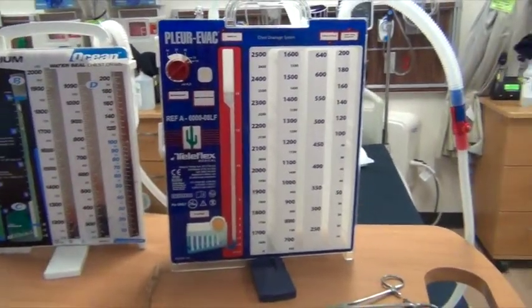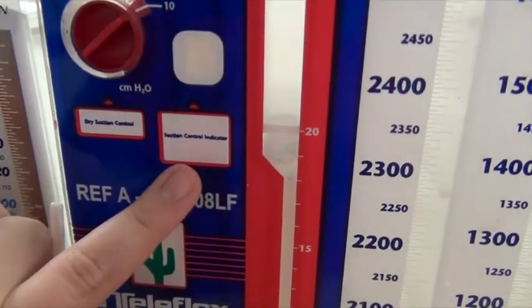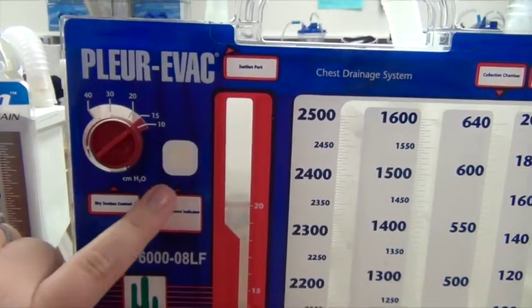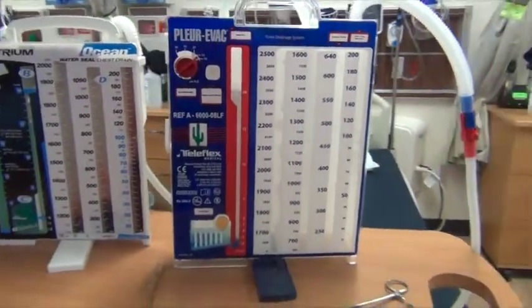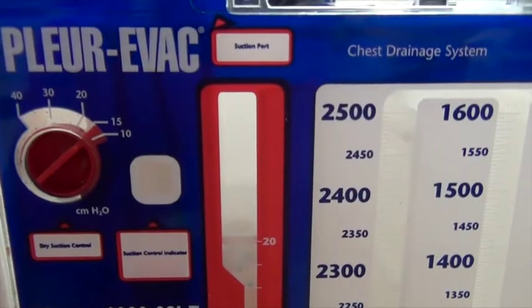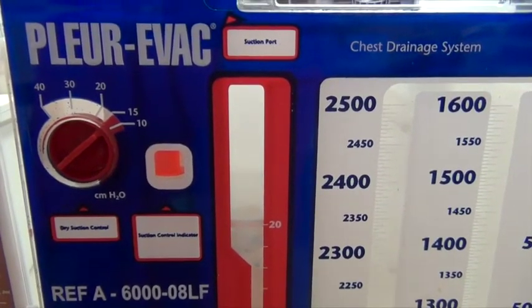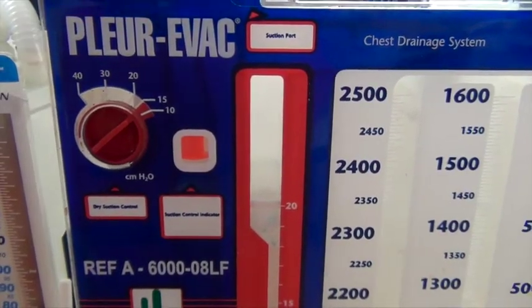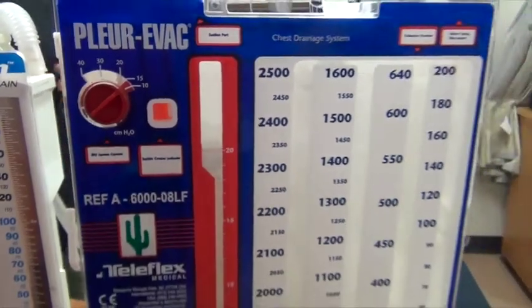Now, as far as adjusting the suction, you'll notice on the dry system, there's a suction control window here. When you have the right amount of suction, a red float will come up and show in that window. I've already turned on the suction and have it set. So watch the window. You see that red float in there? That means I have the suction turned on enough to apply the correct amount of ordered suction for this patient. So that's all you're adjusting for that one.